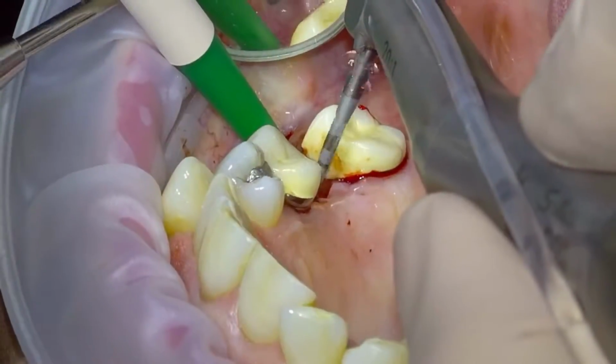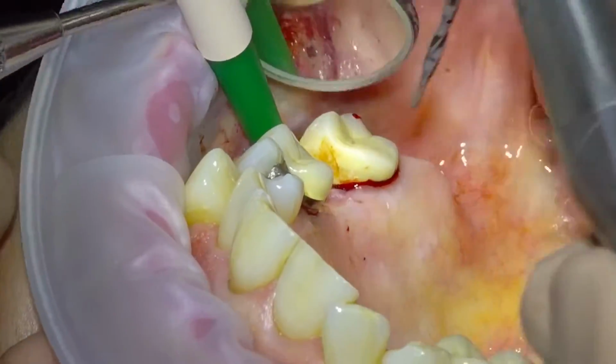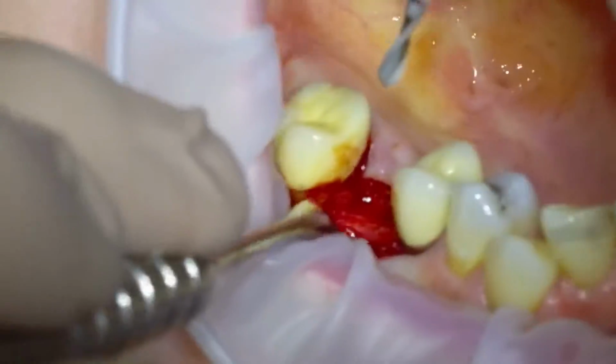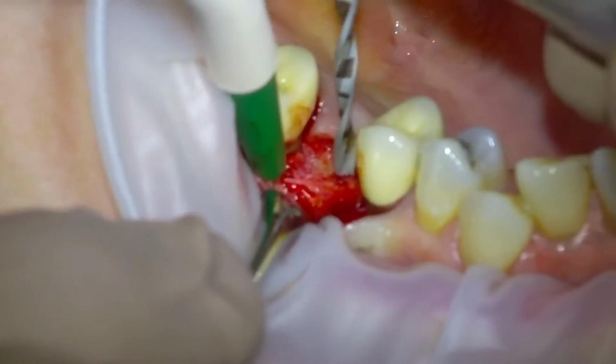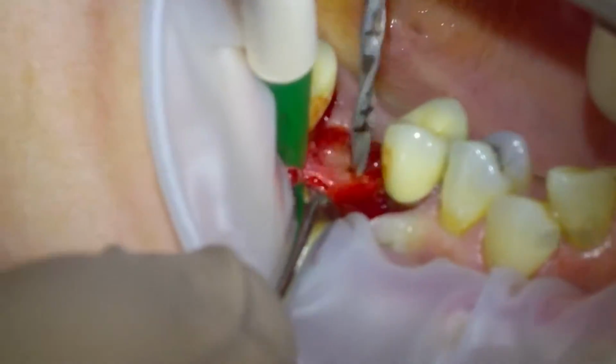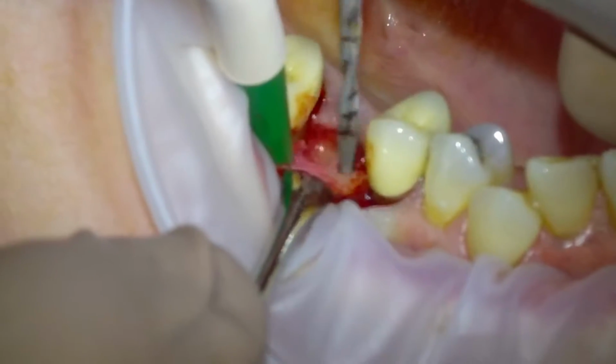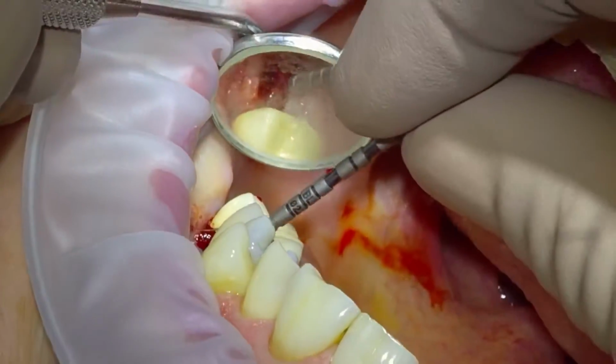This is our pilot drill, which runs at 800 revolutions per minute, and we just do a small little pilot just to get angulation, and then this is the next drill in the sequence. Start with a slightly slower drilling speed, and then up to 800, straight line drilling.